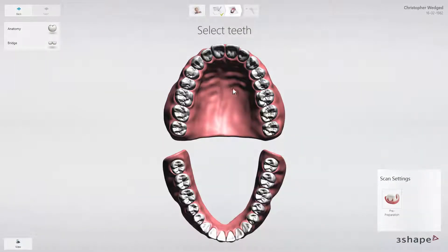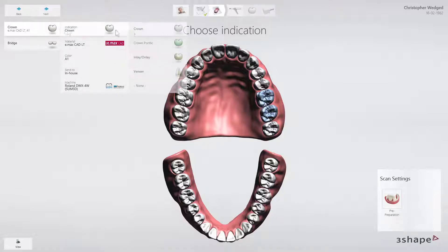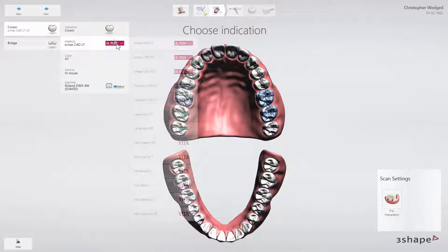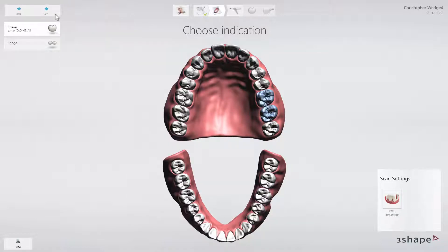To create two single restorations in one order, select two teeth in the order form. Then go to Anatomy and select the type of restoration — a crown in our case. In the Material tab, select the material with which you intend to work.